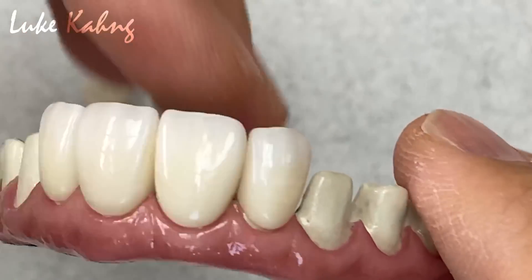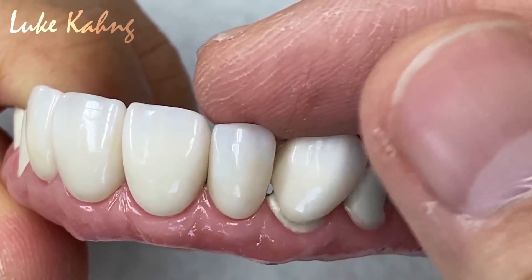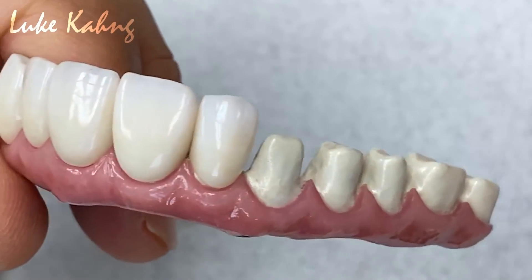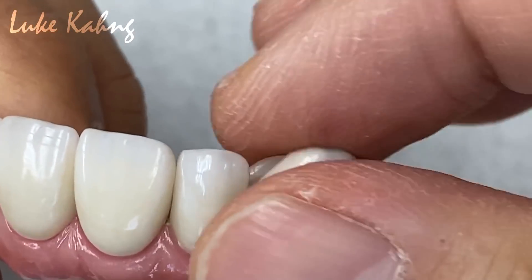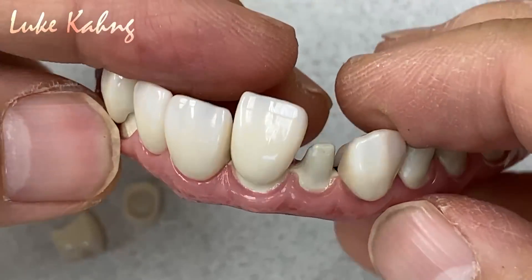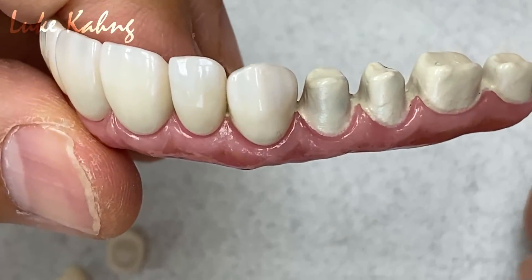Make it one unit. So this is the top of the line — top-of-the-line restoration full mouth cases — at an unbelievable stage. We fabricated the final restoration like that.